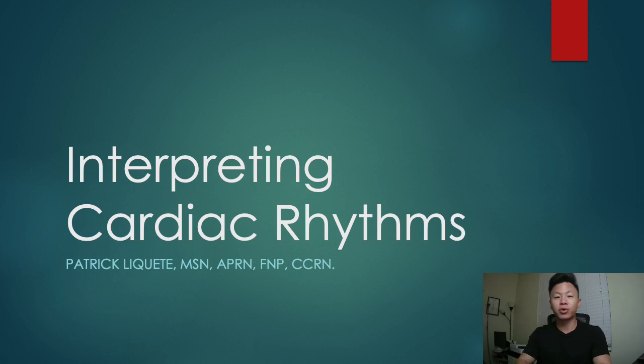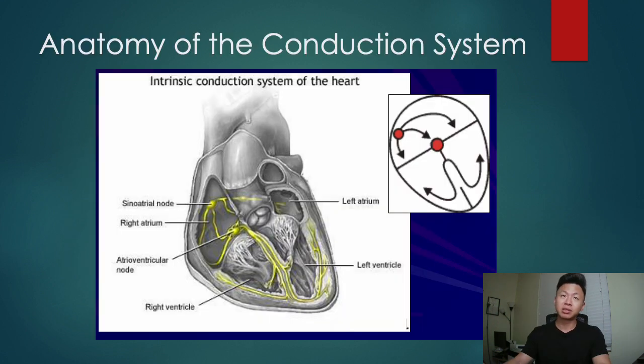So this is an intro course and we're going to learn a little bit about the anatomy of the heart, how the electrical conduction affects the mechanical component of the heart, and what all of this means in your regular EKG strip, right? So let's take a look at a little bit about the conduction system of the heart.